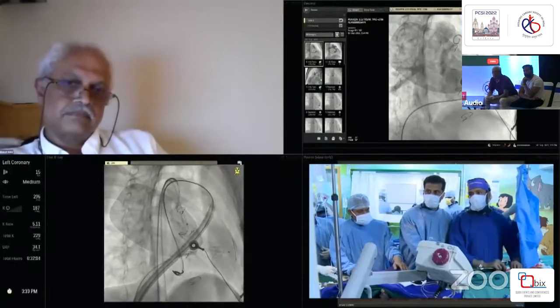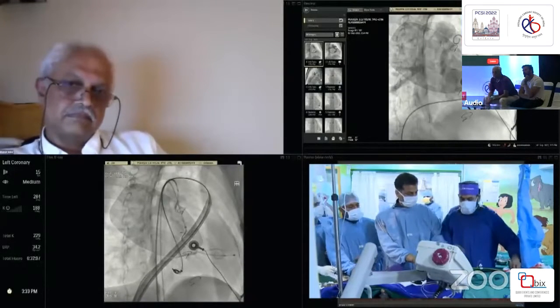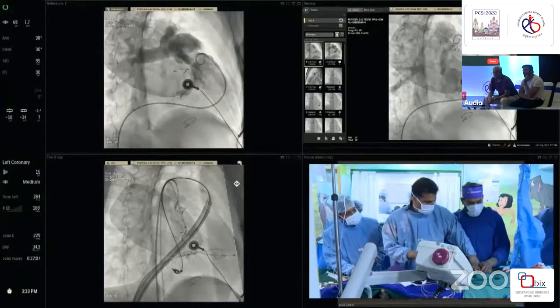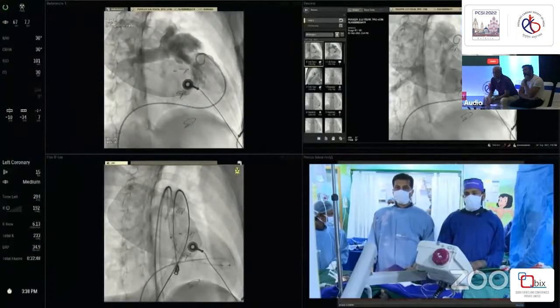It's okay, sir. I think it's okay there. Yeah, looks good. Okay, fine. Come this side. Hold the sheath, sir. Take the electro off. So I'll take the electro off. You hold the sheath. So actually, we have two wires across now with the sheath.